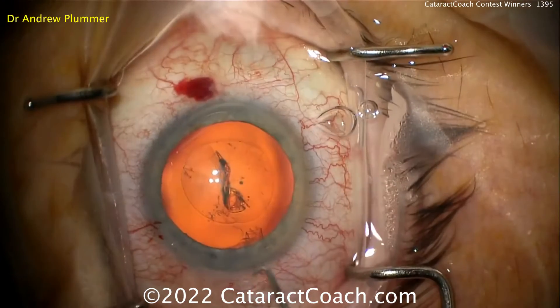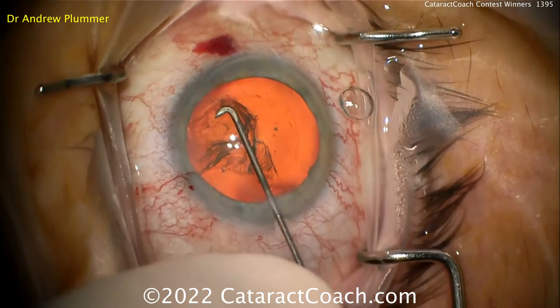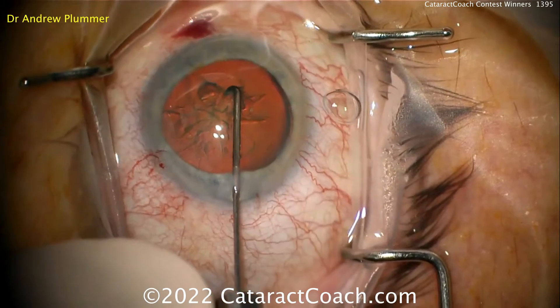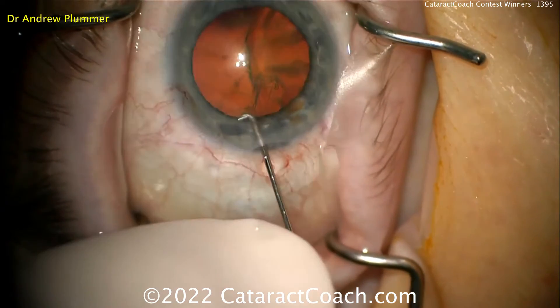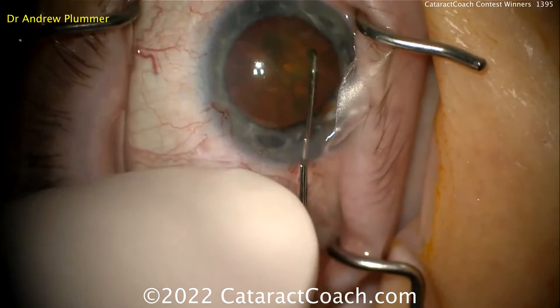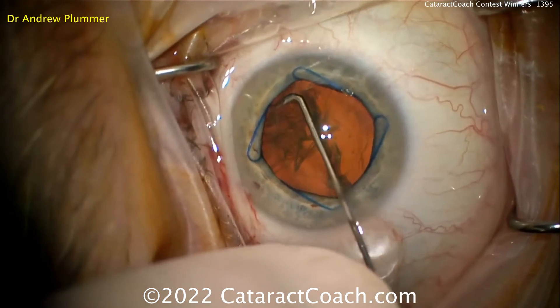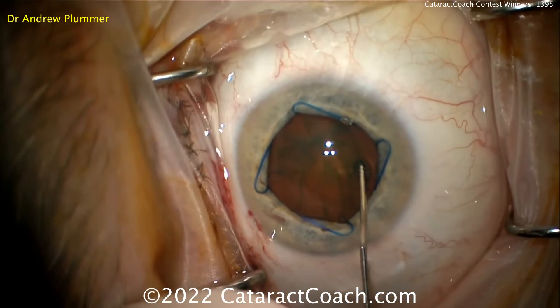A lot of attendings will recommend that you tilt up the anterior capsule so that you can send the fluid wave as peripherally as you can. One thing that wasn't taught to me — I had to find out by trial and error — is that if you do that, you can inadvertently depress the posterior nucleus, which will prevent the fluid wave from passing. So you want to tilt up the anterior capsule without pressing down on the nucleus so that you allow the fluid wave to pass. I also like to use a pushing motion for the first spin rather than a pulling. The cannula has more surface area on its distal pushing end, and I get more purchase that way. It's a very gentle force that puts the capsular adhesions on stretch, those adhesions release, and then the lens spins very easily with minimal force needed.